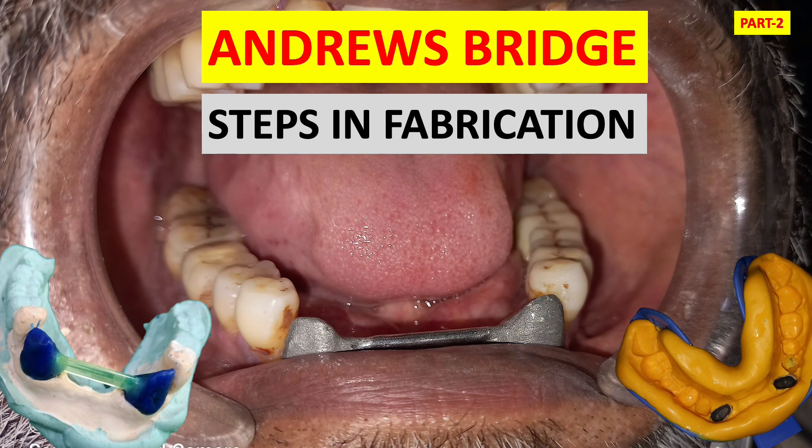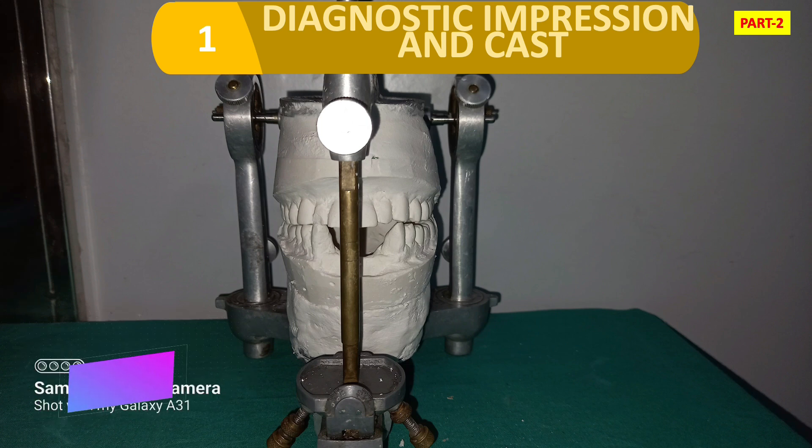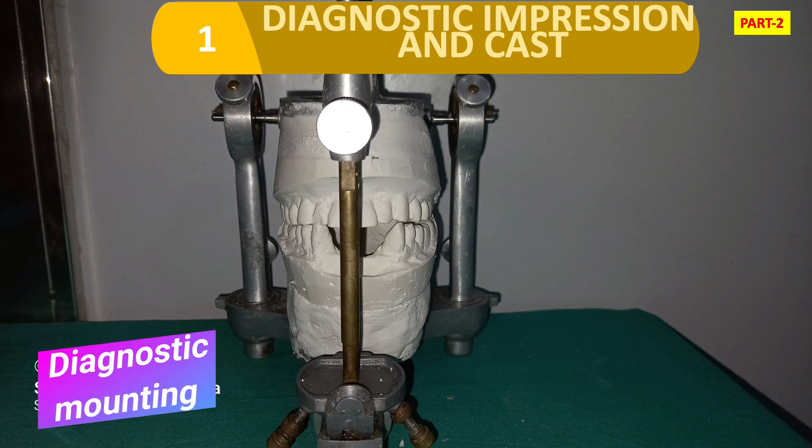The steps in fabrication of Andrew's Bridge, continuing from Part 1. The first step is the diagnostic impression. Look at the figure — we have taken a diagnostic impression for the cast, and the diagnostic mounting was done.